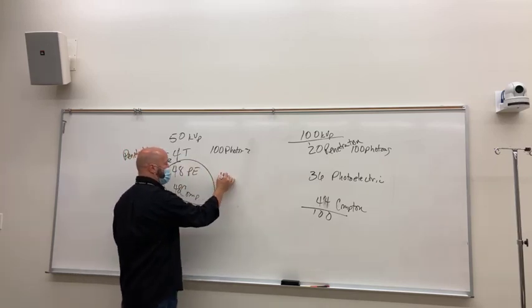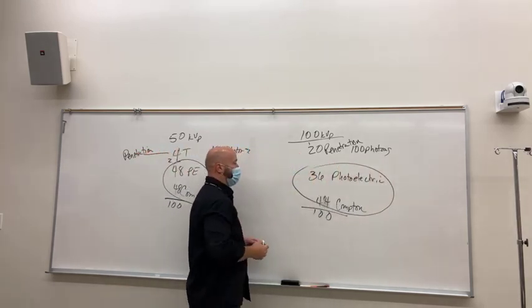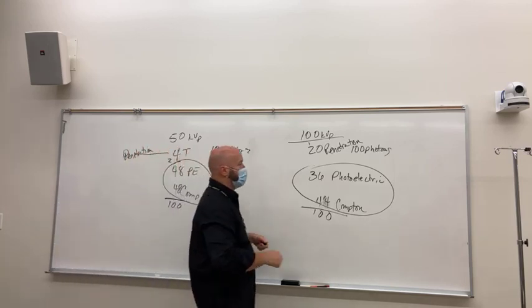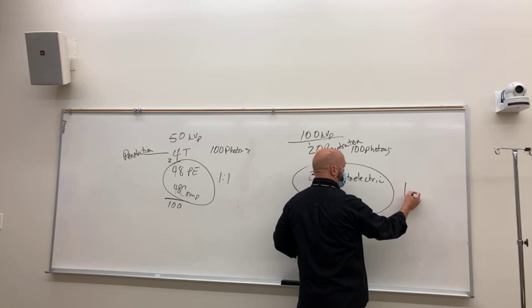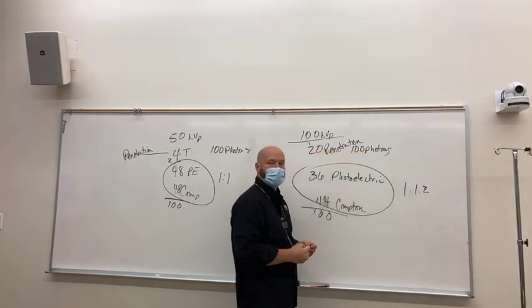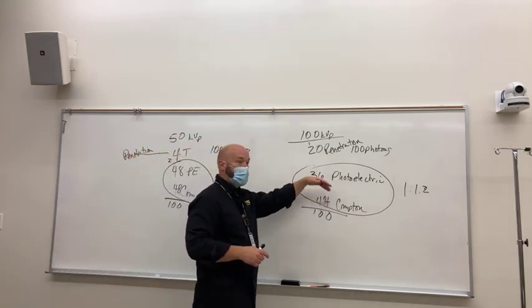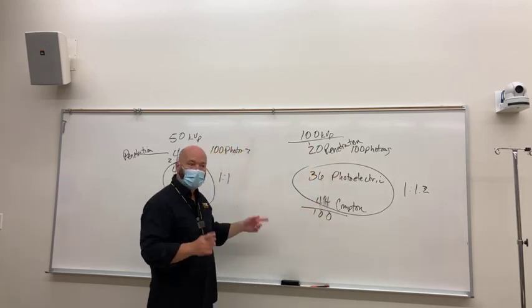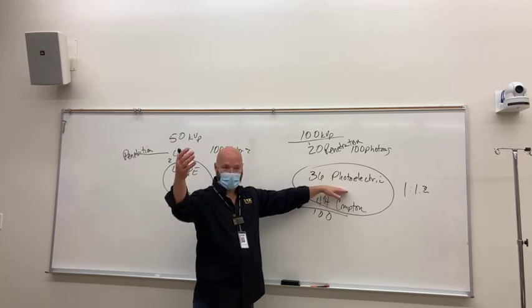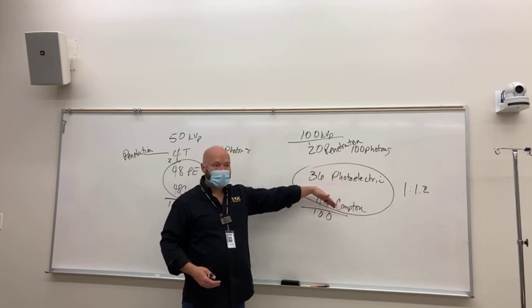It's 1 to 1, right? So what is your ratio here? You have more of which? Compton, right. So photoelectric may be 1, but Compton may be 1.2, something like that, okay? So what that means is that your overall number of Comptons actually decrease, but in relationship to your photoelectric, it holds true that as kVp goes up, your Compton interactions dominate your image, okay?